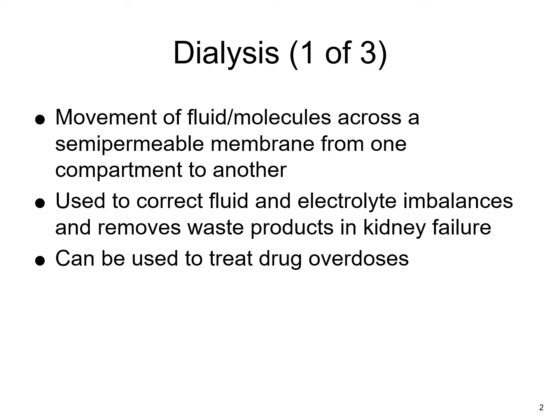If for whatever reason the patient cannot tolerate hemodialysis and maybe they want more autonomy, they want to be at home, so maybe potentially for that patient we're going to be doing things like peritoneal dialysis, okay? But essentially all we're doing is trying to get rid of toxins in our body. So how are we going to do that? We're going to use the principles of diffusion, osmosis, and ultrafiltration. That's what we're focusing on.